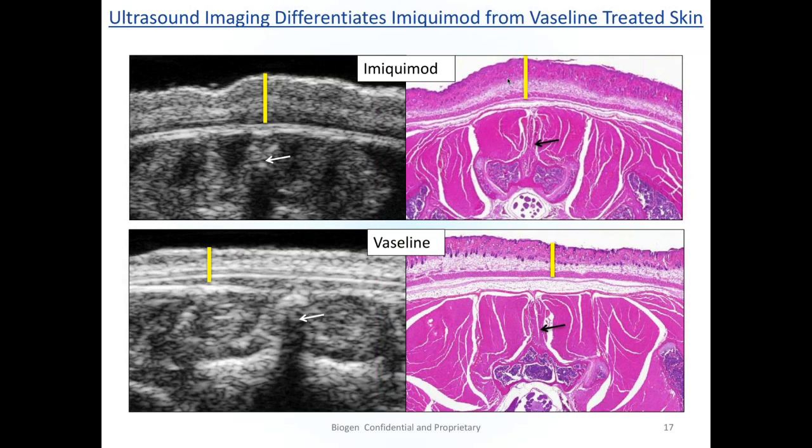So actually the slide, I think everybody can still see it. We found a paper, I believe it was looking at the Imiquimod model, in which they had some Doppler data. As I said back in the beginning, we tried everything on these different models. There wasn't really a justification in the other two models. There's not a lot of known vascular changes, maybe a little bit in the tweak model. But we started with this model because there's such an inflammatory infiltrate, and it's known to have vascular changes in the dermis and epidermis. And we'd seen this one report of Doppler. And we tried both contrast and Doppler on this model.